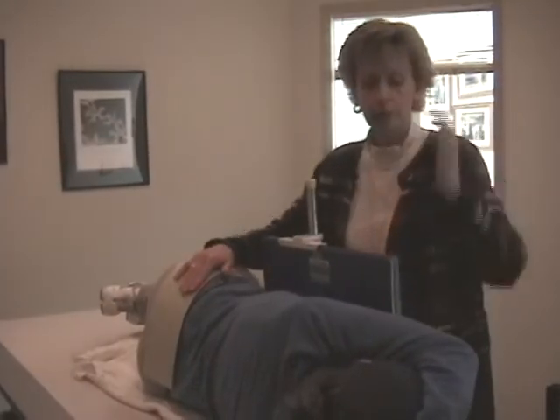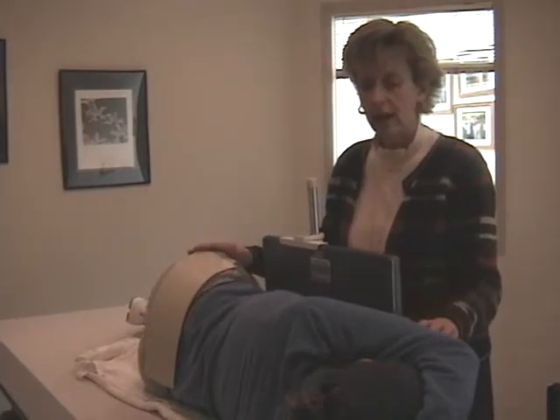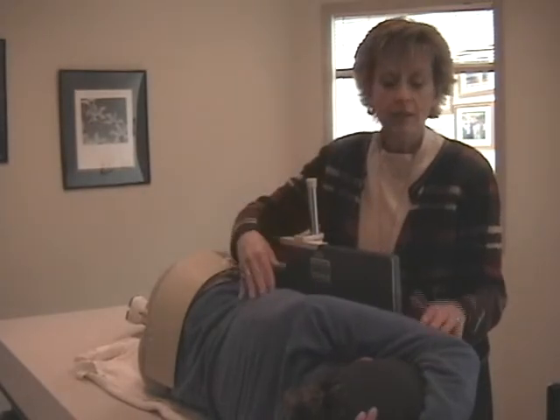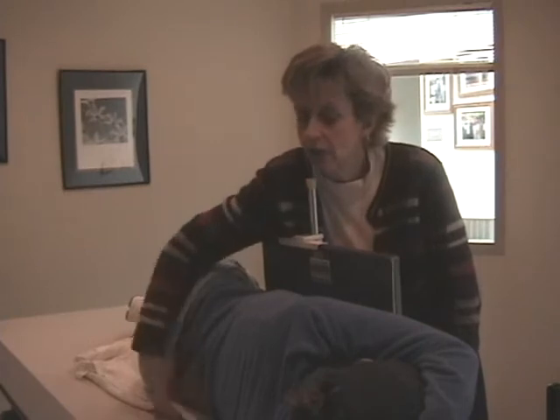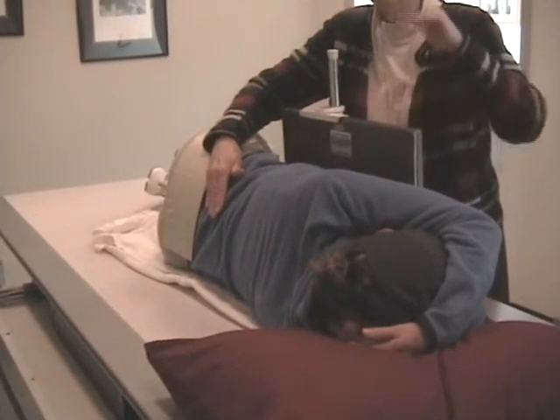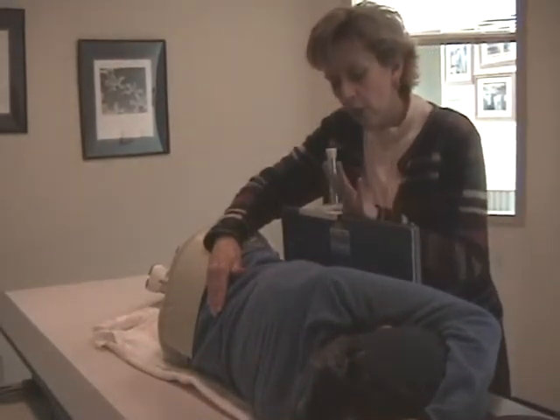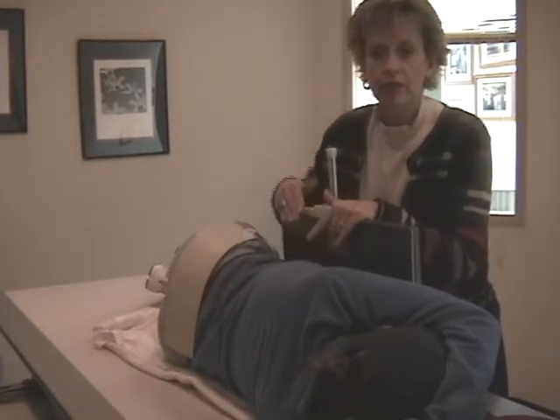I'll show you the marker placement in just a second. But since she's all positioned nice, again, 40 inches SID. She's on her right side in this scenario. And take a look right down here. She's actually on a blanket, or what you could use as a pad. And the cassette is not up on the pad. The cassette is lower than the pad. It's flat on the table, and the cassette is close up against the patient's body. Patient is straight in a true lateral position.